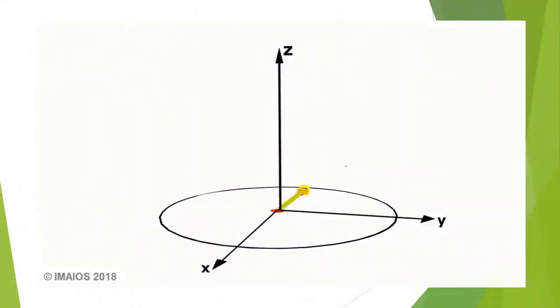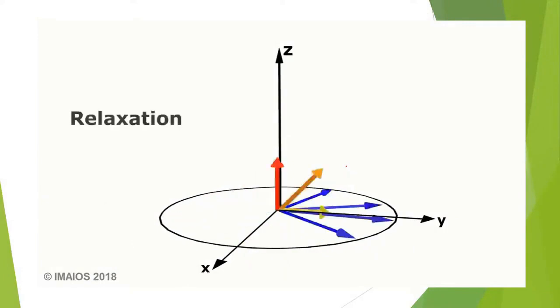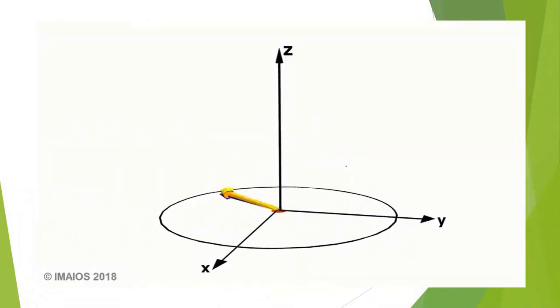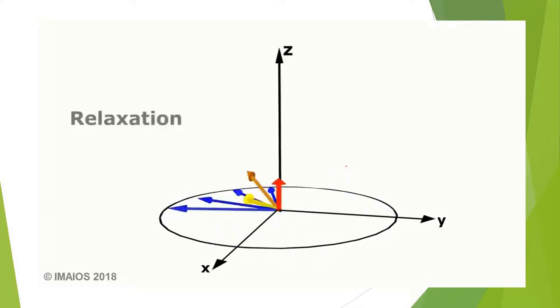Look, I'm talking about the 90 degrees, right? For sure, relaxation happens after the 180. What happened? You said the 180 is effective. The protons are starting to regroup again. The phase is visible. Look here, they started to spread out. Here, at 180 degrees, they begin to come together again.